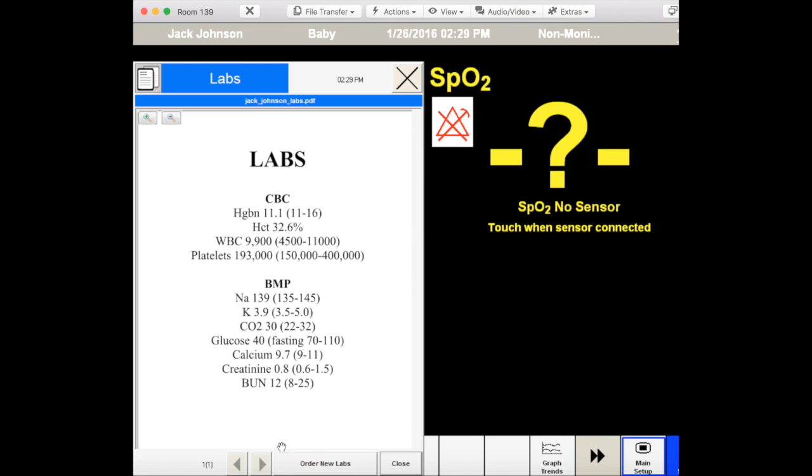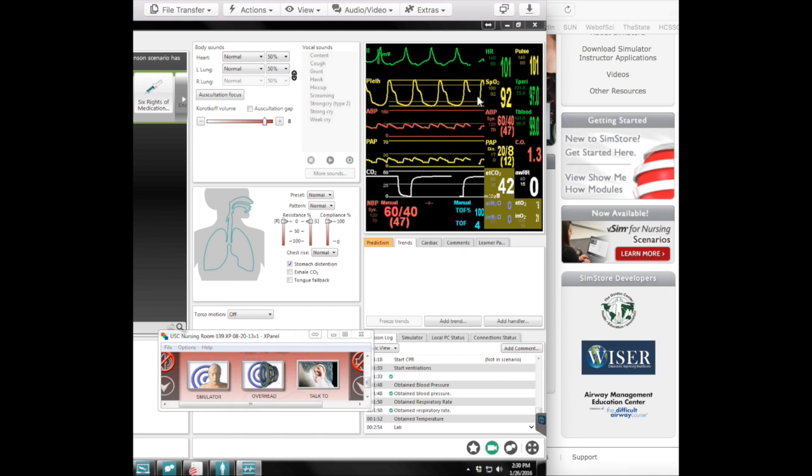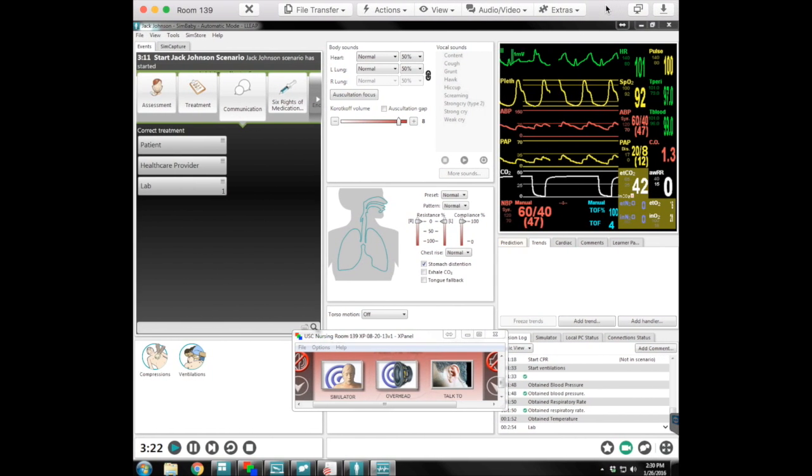And you always have a copy of this in paper form. That's in your scenario packet when you sit down at your control station, so you can follow along when they make a phone call to talk to you. But that's pretty much it. It's just a checklist-driven situation.